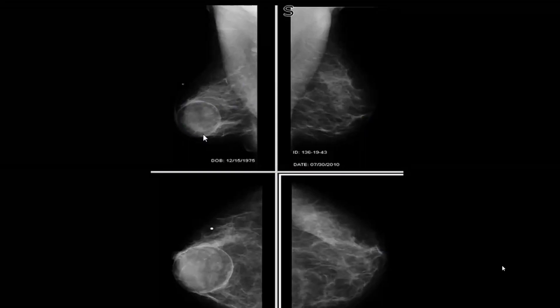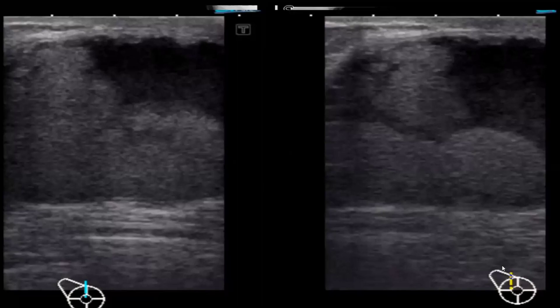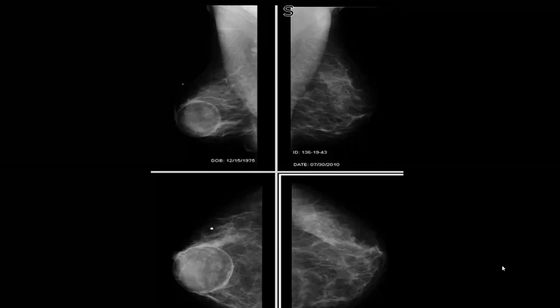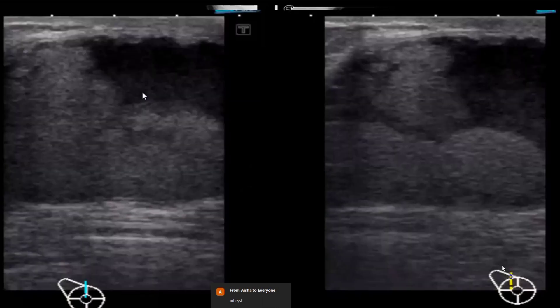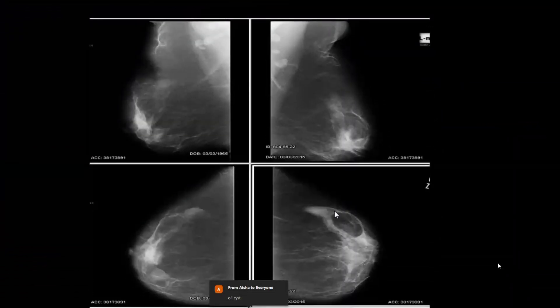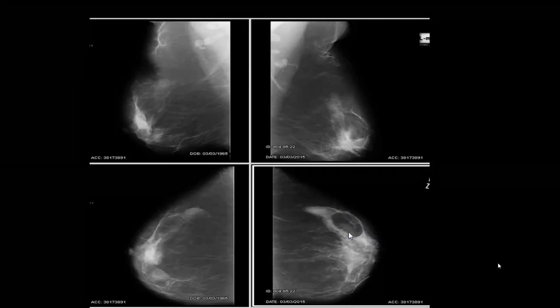The right breast shows a well-circumscribed mixed-density lesion in the retroareolar location with some calcification around the wall. There is no need for ultrasound — this is an oil cyst and you can safely give it BIRADS 2. The ultrasound appearance may look suspicious, but whenever you have a similar case in your exam, give it BIRADS 2 and don't ask for ultrasound. Similarly, a lucent lesion in the left upper outer quadrant is a case of left breast lipoma — again BIRADS 2.